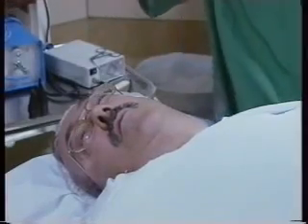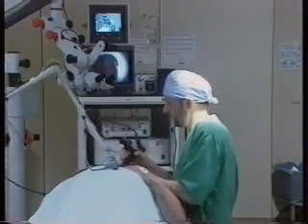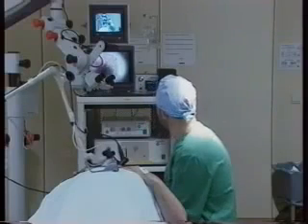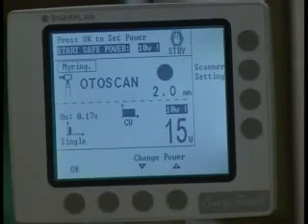At the start, the computer suggests default standard working parameters. The doctor can choose the diameter of the tympanostomy and the shooting power. The recommended diameter is 2 millimeters. If the CAE is curved or narrow, access can be reduced, and you should then use a tympanostomy of smaller diameter, but which will close more quickly. It's better not to exceed a diameter of 2.5 millimeters to avoid residual tympanic perforation.